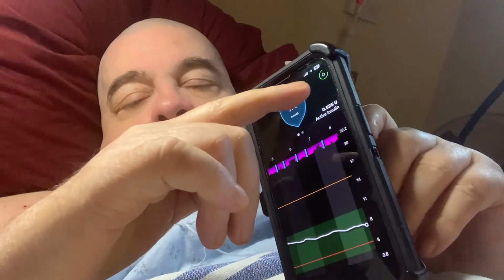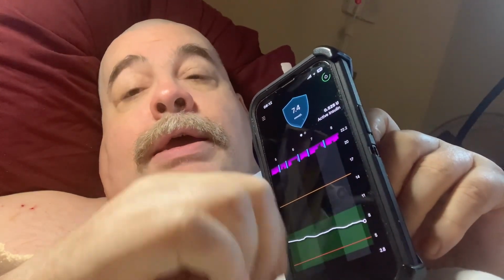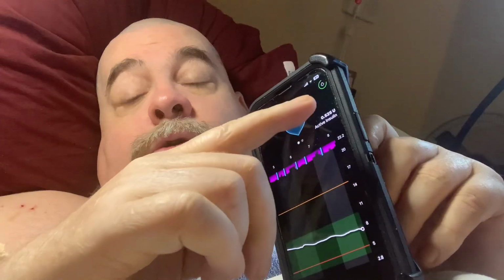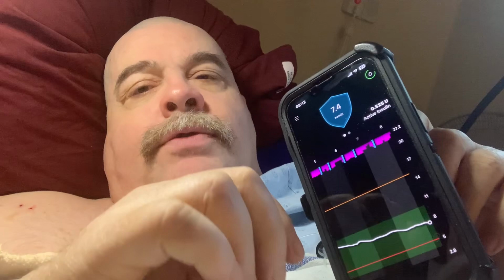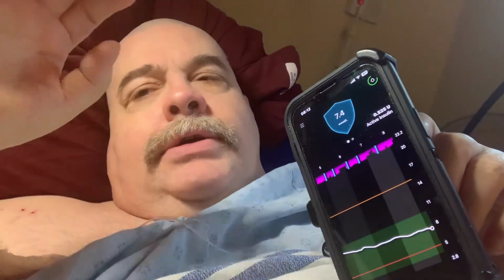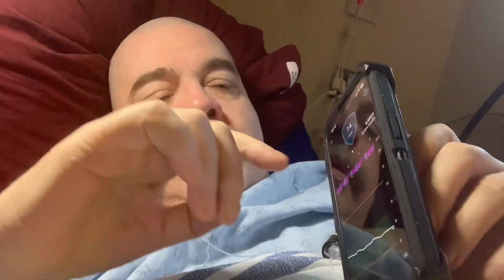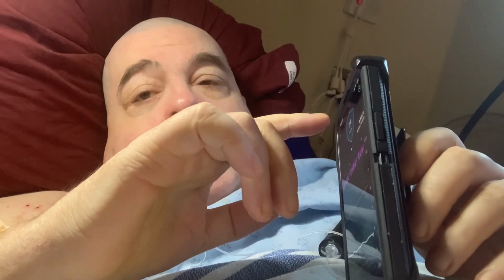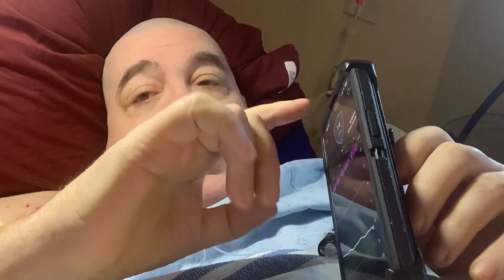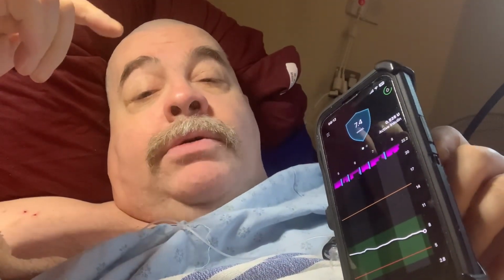I've talked about this little droplet up here. This tells me how my calibration is going. It'll go green, and then it'll change to sort of a yellow color. Yellow is saying, hey, you're gonna have to calibrate soon. And then it will go into a red mode, and red is kind of saying, hey, listen to me now. You need to do it now.